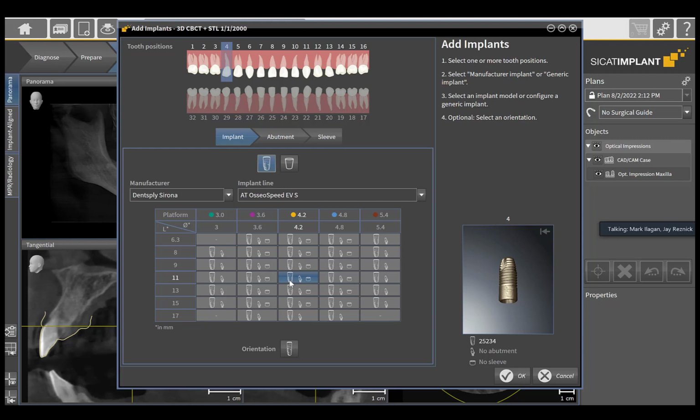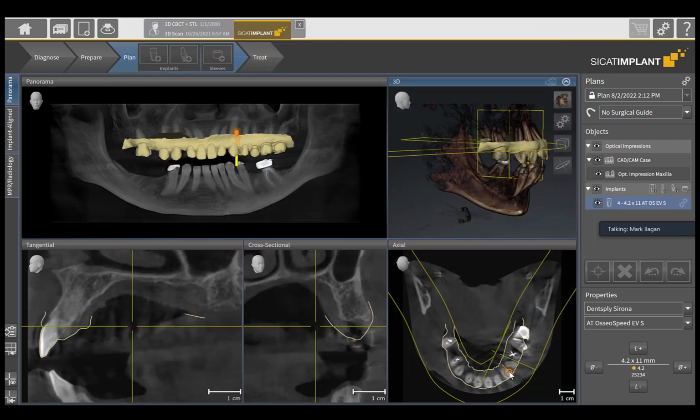Do you have an implant that you prefer today? I'm sorry, do I have what? Do you have a specific implant you use? I use the OsseoSpeed EV. I use the Nobel, the conical connection. Those are kind of my two most common. Okay. I use the BioHorizons implant. Occasionally Straumann, but not all that often. Okay. But basically, the Astra and the Nobel are my most common.